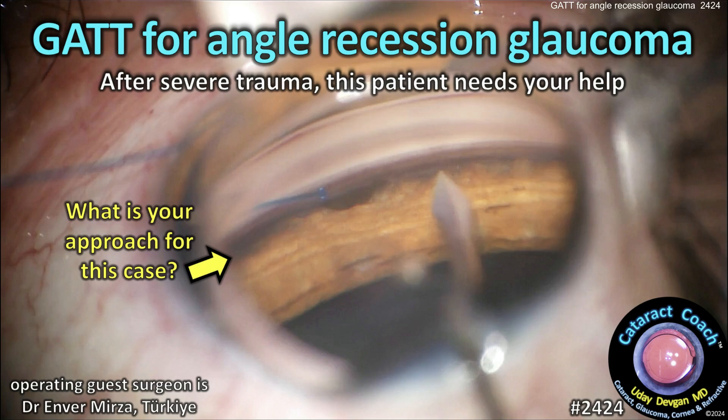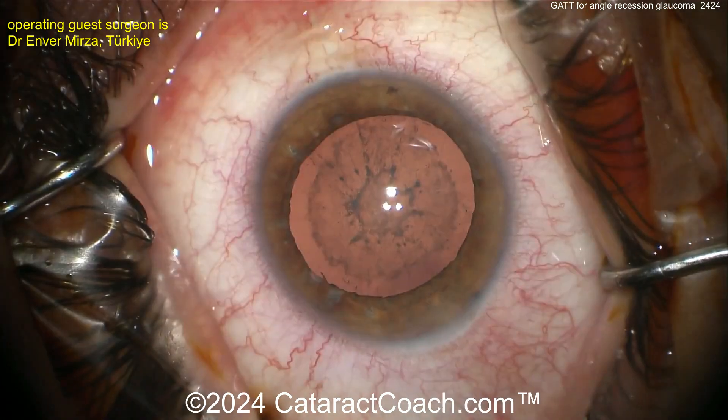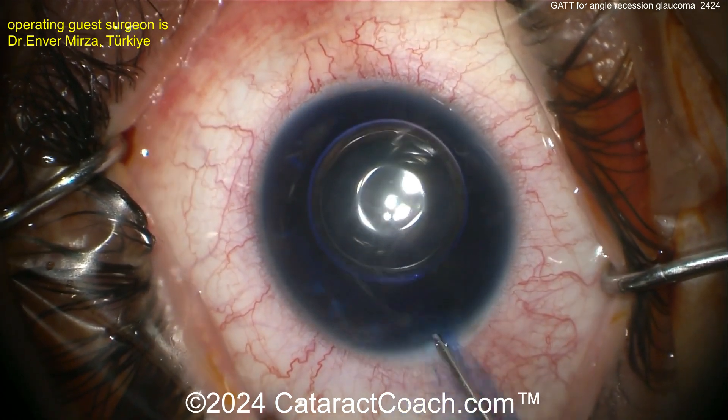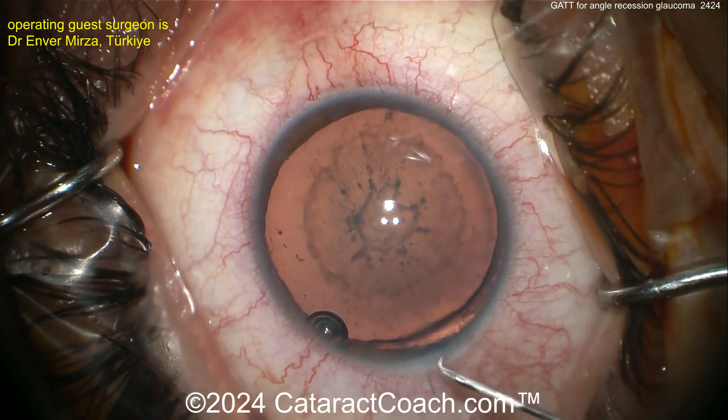cataractcoach.com — GATT for angle recession glaucoma after severe trauma. This patient needs your help now. What is GATT? Gonioscopy-assisted transluminal trabeculotomy. Let's watch the case. The patient has sustained severe trauma recently.